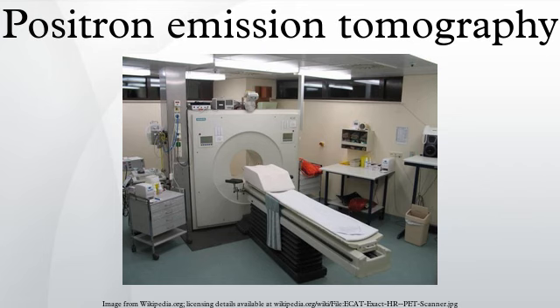Post-mortem examination of AD patients has shown decreased levels of acetylcholinesterase. 11C PMP is used to map the acetylcholinesterase activity in the brain, which could allow for pre-mortem diagnosis of AD and help to monitor AD treatments.